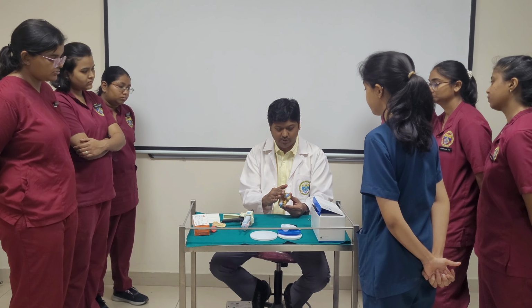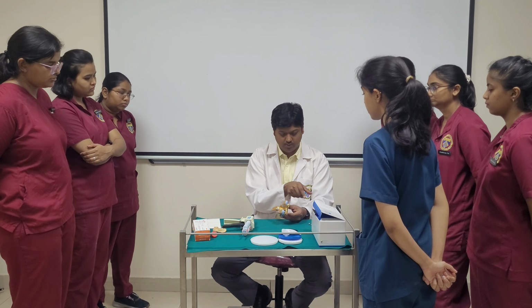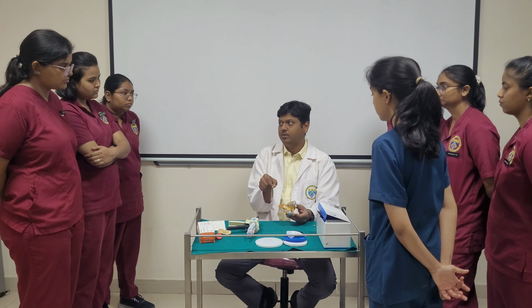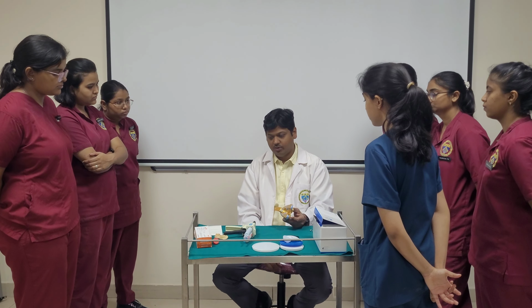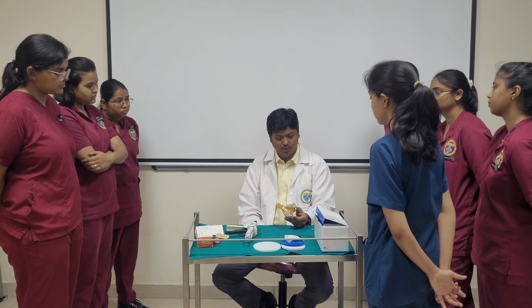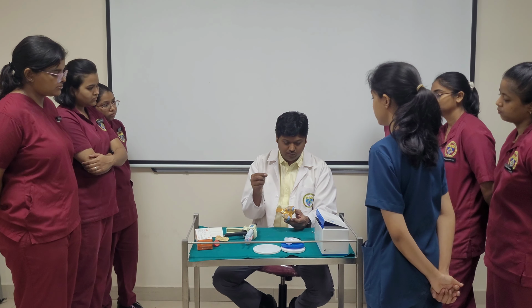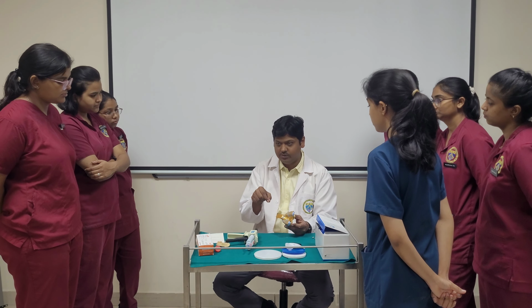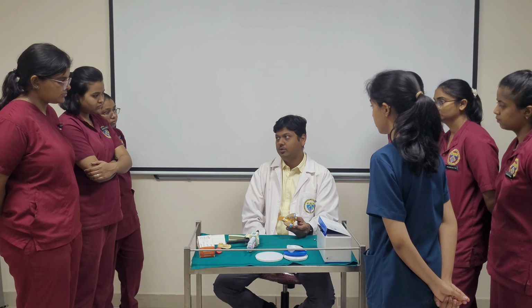After the material is set, we will take out the tray and unscrew the transfer coping from the patient's mouth and manually put it back inside the impression. That is the biggest disadvantage or drawback, you can call it. There is a chance of human error. Taking it out from the patient's mouth, the technician or doctor has to place it inside the impression manually, so a little bit of orientation may change.